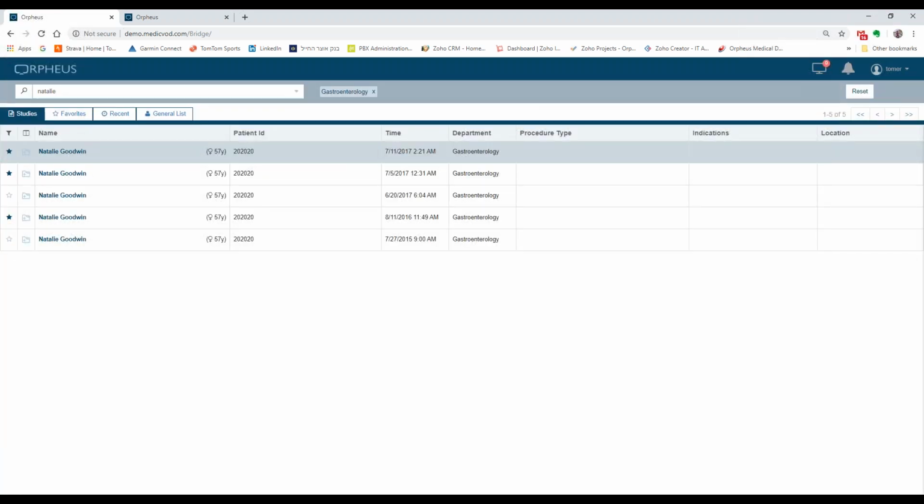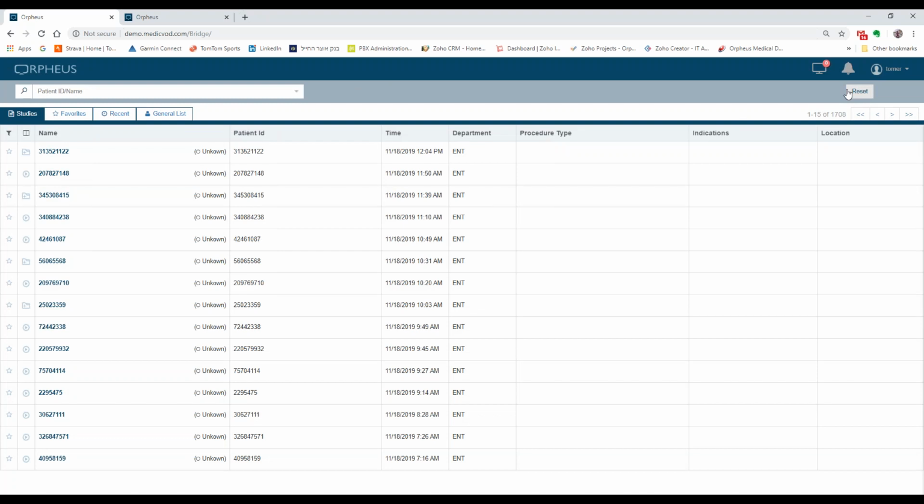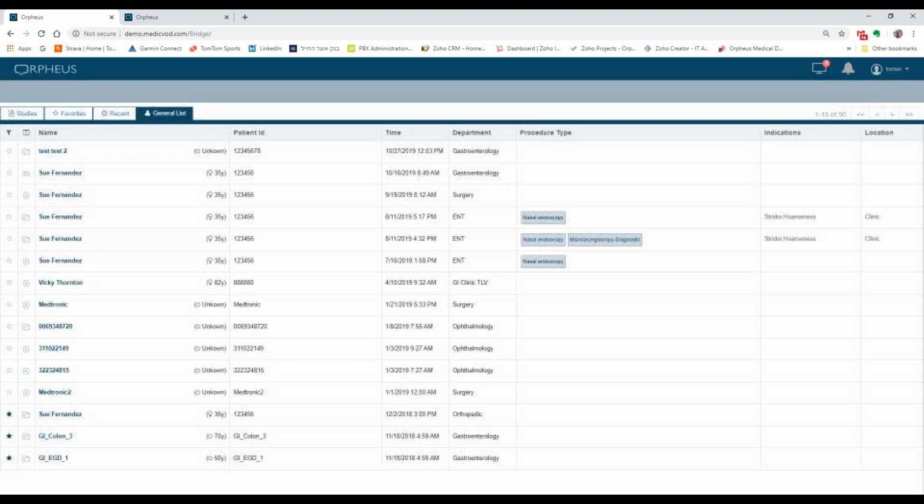No, I think that's good, Tomer. It seems like it's going to give the physicians more capabilities than they currently have. For sure. Yeah, this is what we wanted to cover today, and like I said, it's really the basics, or even a little bit more than the basics, but definitely enough to get them started. And as they use the system, we are certain that they're going to discover more and also want more and ask more questions, and we'll be happy to address those and provide more insight and direction.